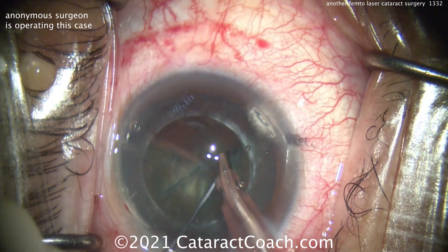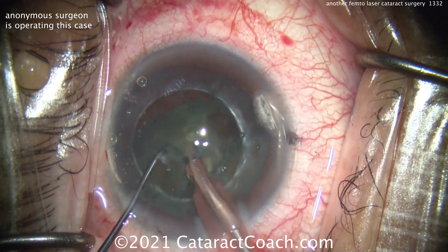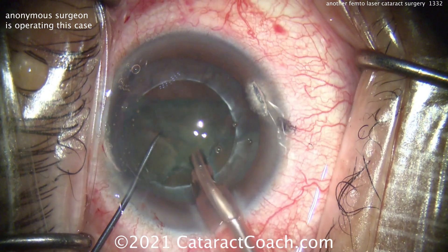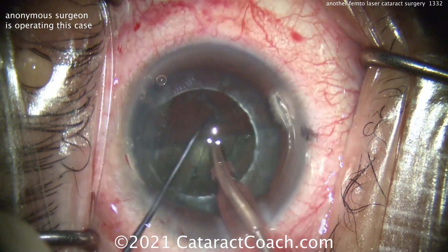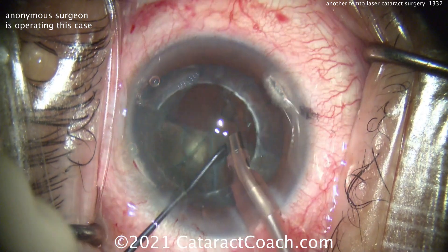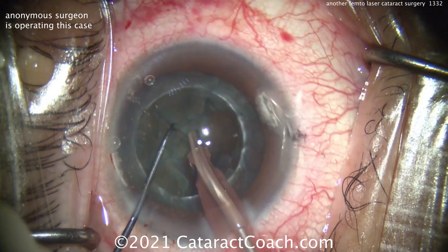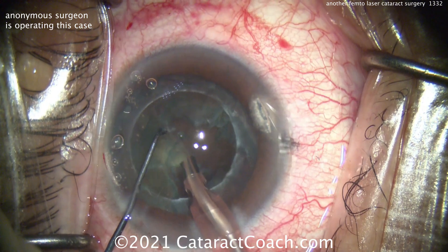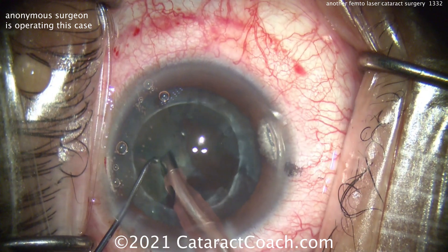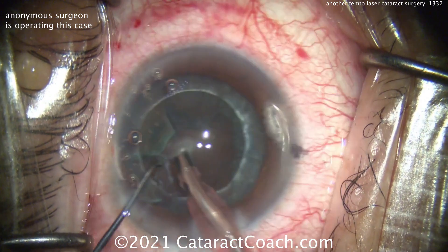And you can see slowly taking off pieces of the pie at a time. And here's the next piece — separating first and then bringing it up. You could probably just bring the whole remainder up to the iris plane or the capsulotomy plane and emulsify it. Look at that edge of the capsulotomy — you can see where that laser energy has gone through and cut some of that anterior cortical material too. So you've got to be a little more deliberate in your cortex removal during IA. Here's the last bits of the nucleus coming out.